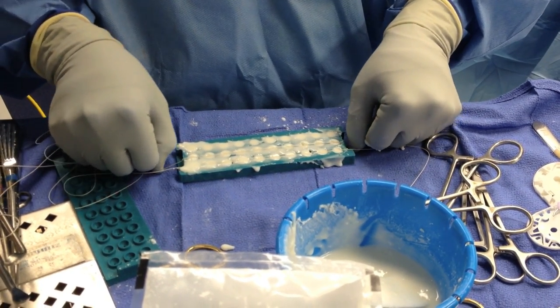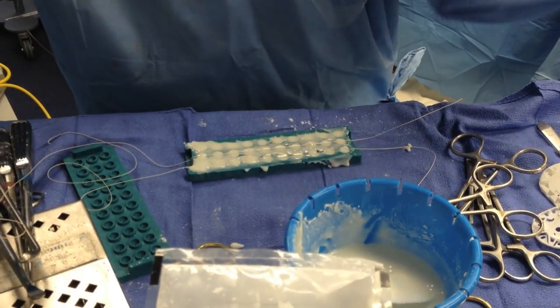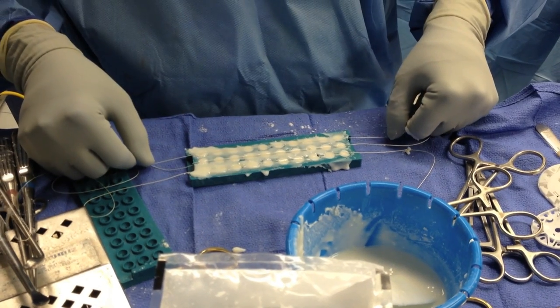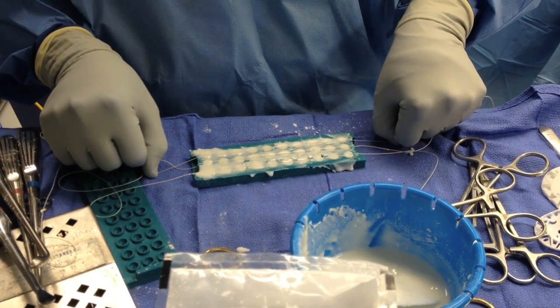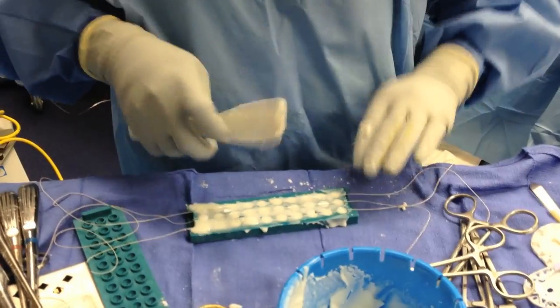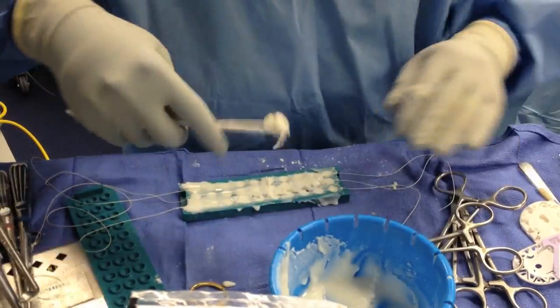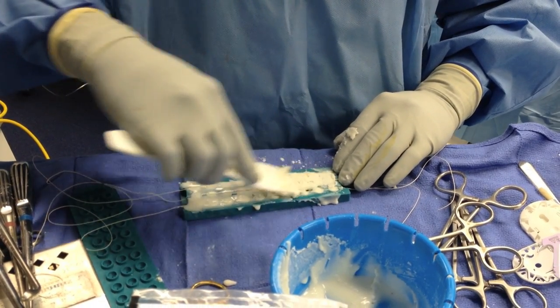However, in this instance I'm using large gauge antibiotic covered vicryl suture which is absorbable. We then top this off with a small amount of additional cement to make sure the sutures are in place as well as to ensure that all of the holes are properly filled with cement.